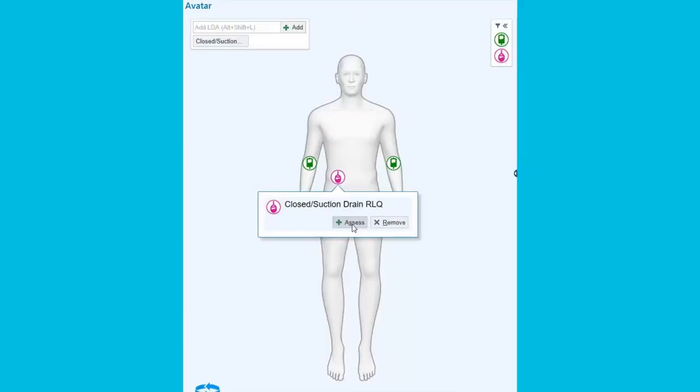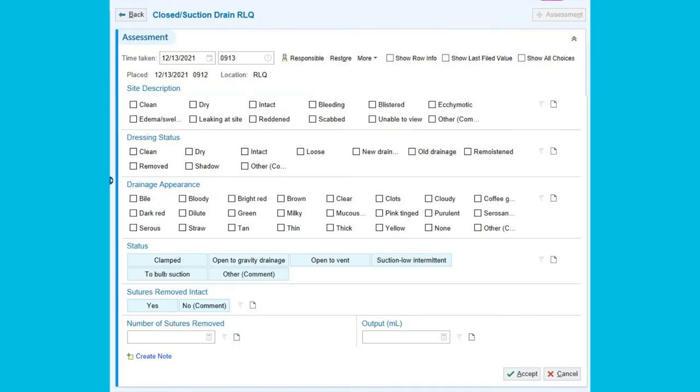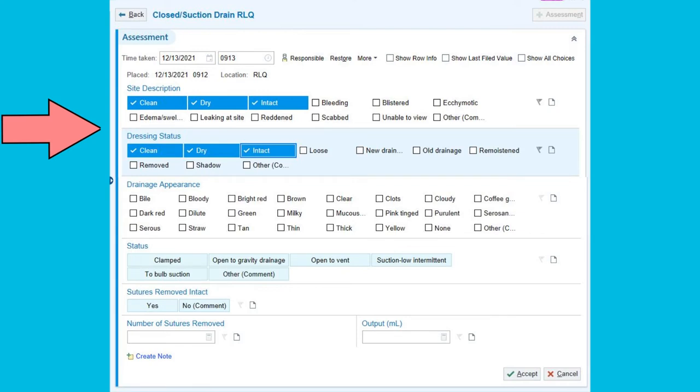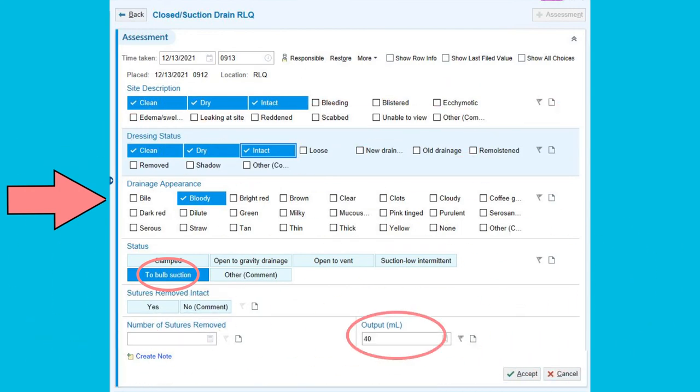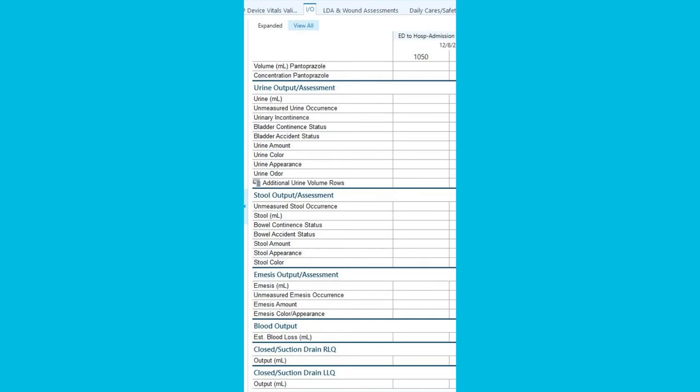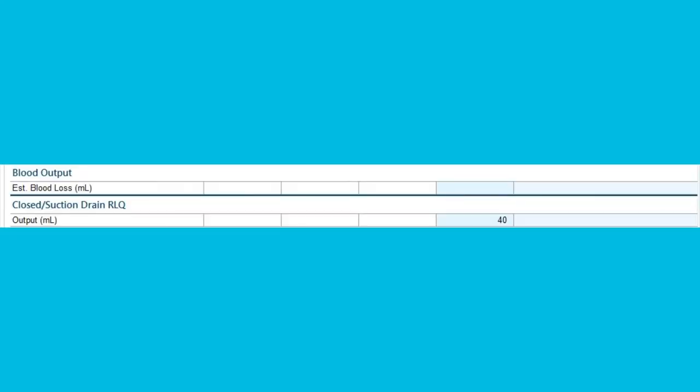Now you need to document what was done. Go to the LDA avatar and click on the appropriate drain. For nurses, you will document site assessment. For nurses and PCTs, you will chart the drainage appearance, that it is set to bulb suction, and the amount of drainage. Then accept. This will populate information in the flowsheets, and if we go to the INO flowsheet, in the right lower quadrant drain, we can see the output we charted on the avatar.